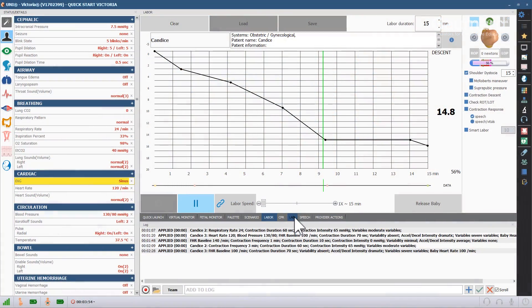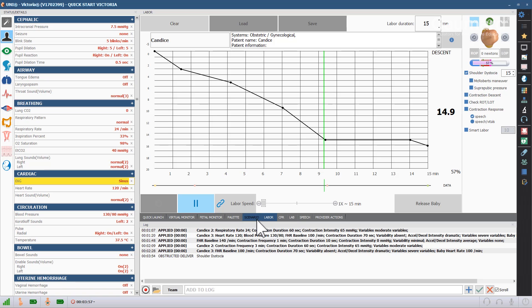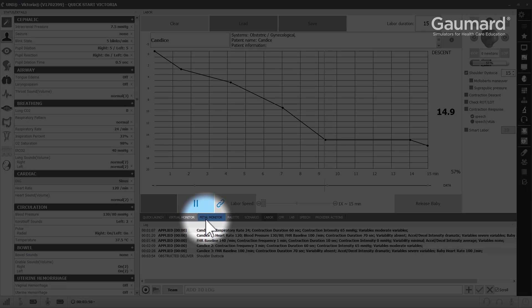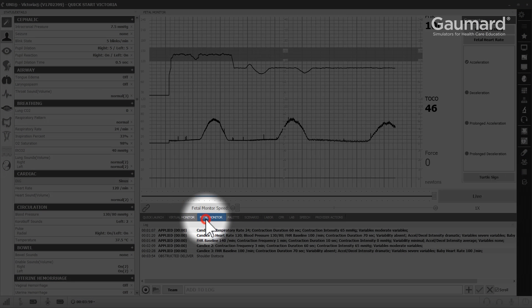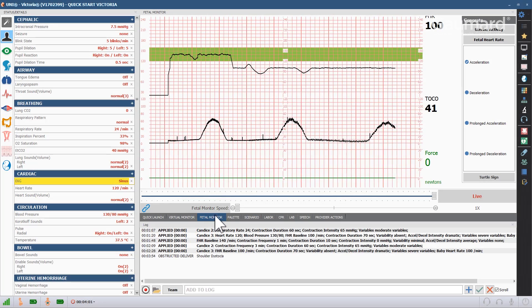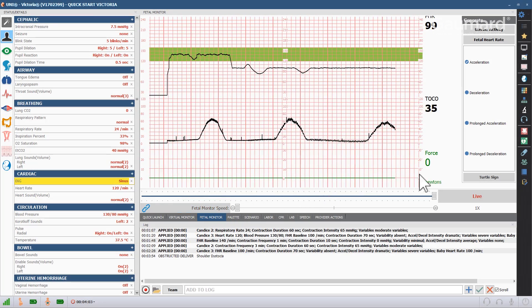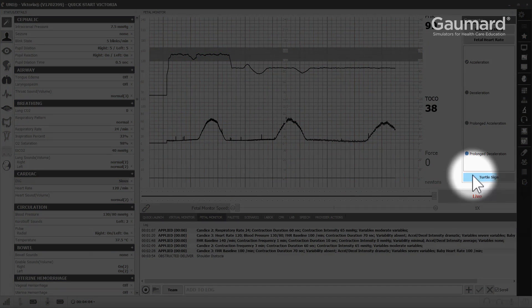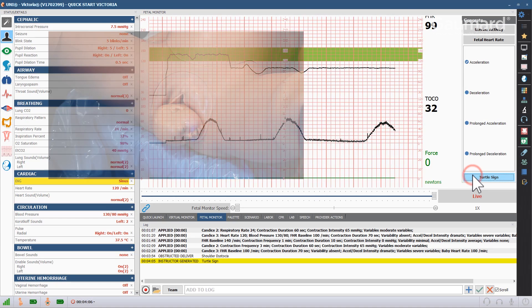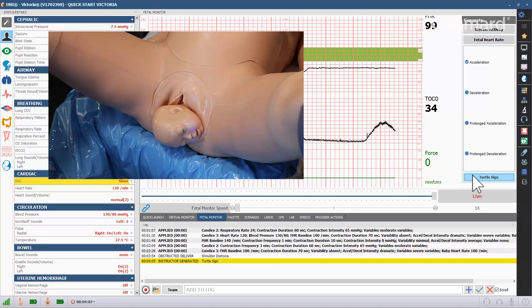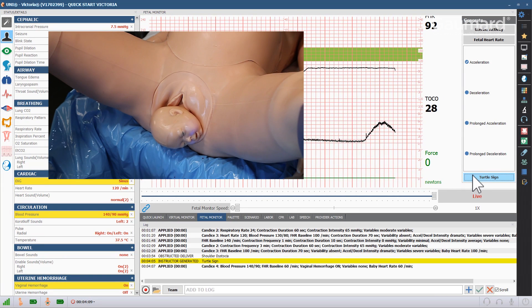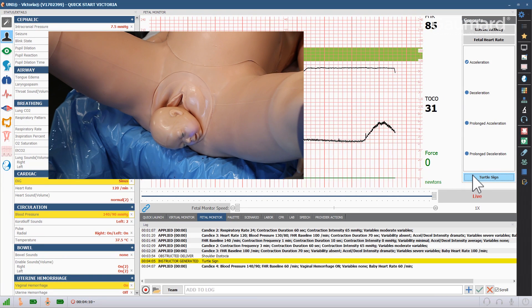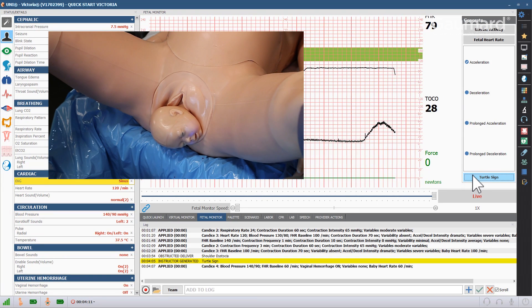When the labor curve reaches the shoulder dystocia event, you can manually generate turtle signs in the fetal monitor screen. Click the turtle signs button to generate a spontaneous turtle sign. The software will document any turtle signs for debriefing later.